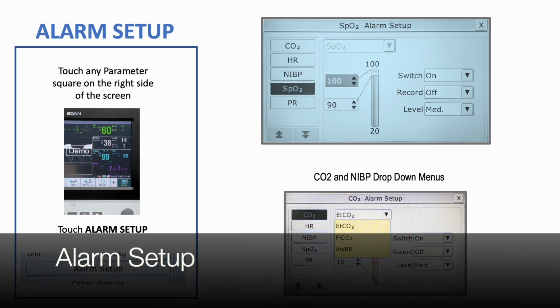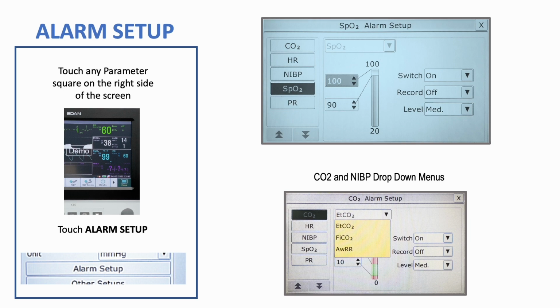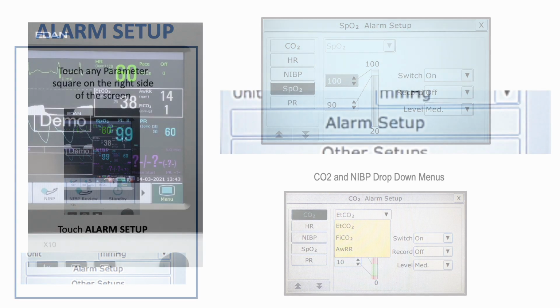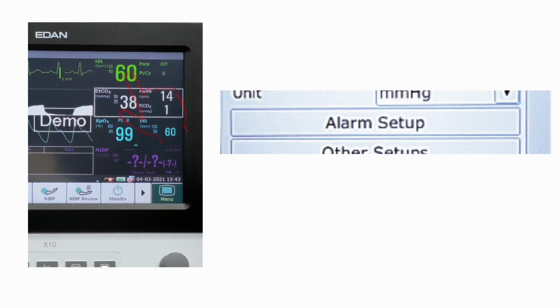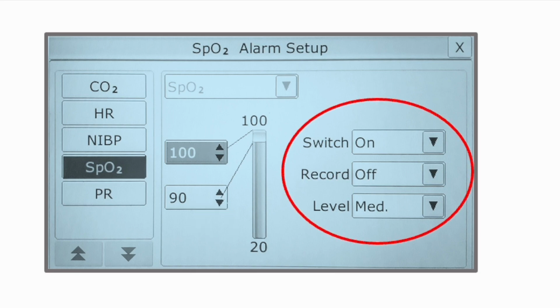Alarm setup. All alarm settings, with the exception of the apnea alarm, can be set from a single screen. Touch a parameter tile on the right side of the screen. Touch Alarm Setup. Once in Alarm Setup, select the parameter to be adjusted. Then touch the alarm value and adjust with the arrows. On the right side, check the settings. Switch on indicates the alarm is on. Record should be set to off to avoid a waveform printout when an alarm is triggered.